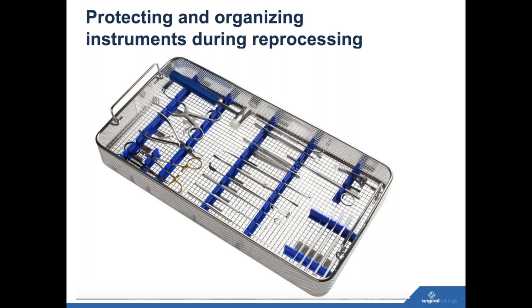But I've also seen stringers are an interesting thing for us in the UK, because we only tend to see Mayo instrument pins, but you've got some quite advanced stringers in the US, Bob, I think, haven't you, that allow instruments to be fully opened and fixed so they can be cleaned. I've seen a few good looking products there. Yeah, we've got quite a few of those products here. Some actually will expand, and then others just come in a measured width where they'll hold the instruments farther and farther apart.